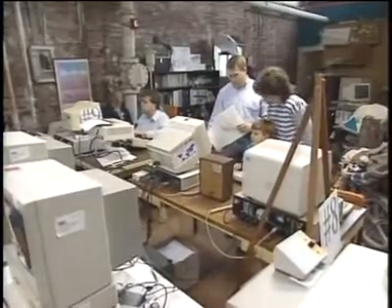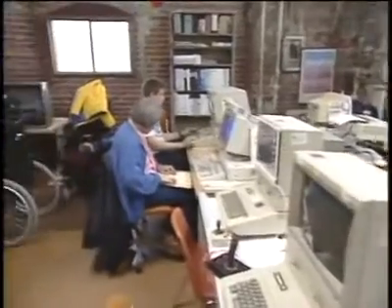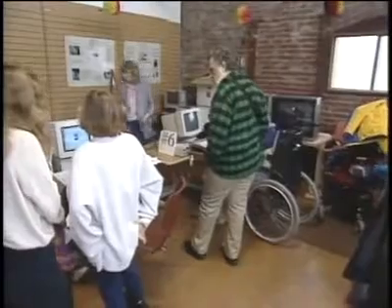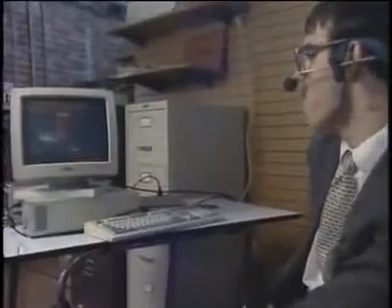Lisa Wall says that people with disabilities are benefiting from the general interest in voice input as a user-friendly interface for all computer users. They're trying to make computers friendlier for everybody, and that's going to make the biggest difference for some people with disabilities. We see people who are temporarily disabled with carpal tunnel syndrome from too much typing, and if they could use their voice for a while and give their hands a break, and then people with physical disabilities who could talk, and people with learning disabilities where spelling is a big problem.